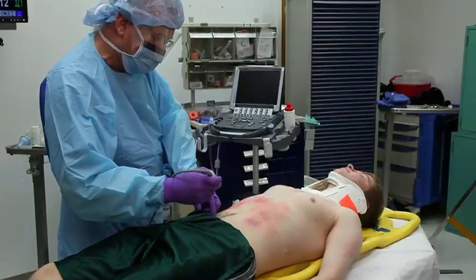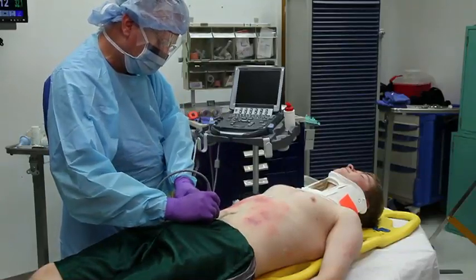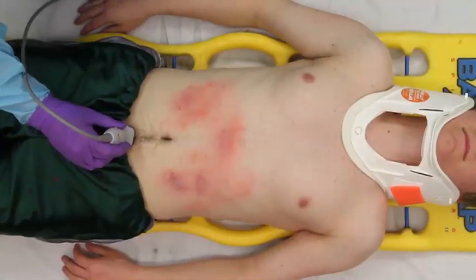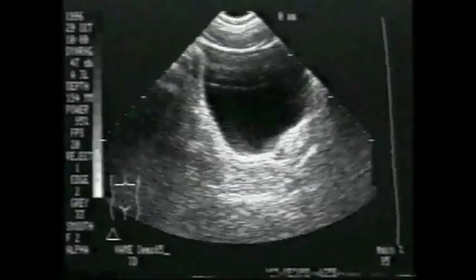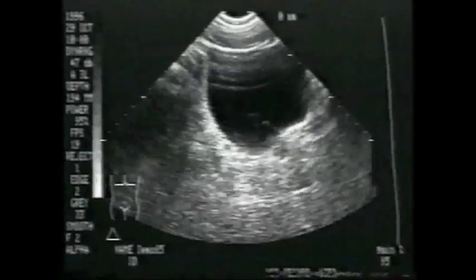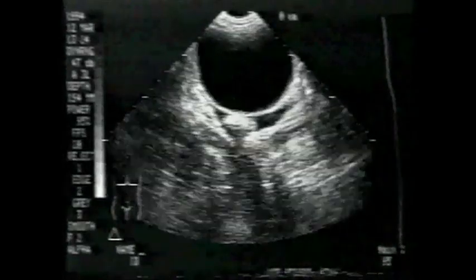The suprapubic view is a transverse view that is best to obtain prior to placement of a Foley catheter. In this view, the area behind the bladder is examined for the presence of fluid, which if present is abnormal and consistent with hemorrhage in the trauma patient.